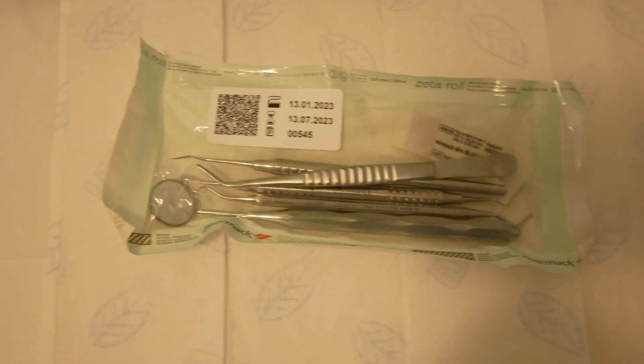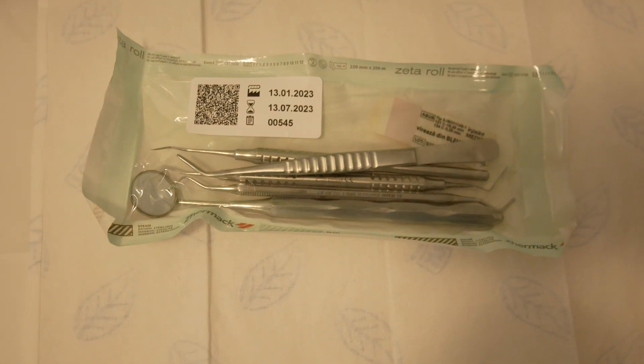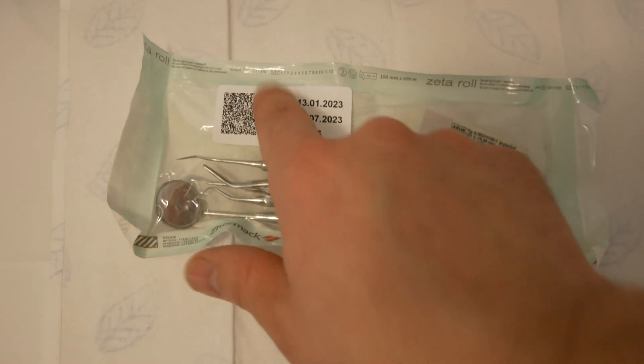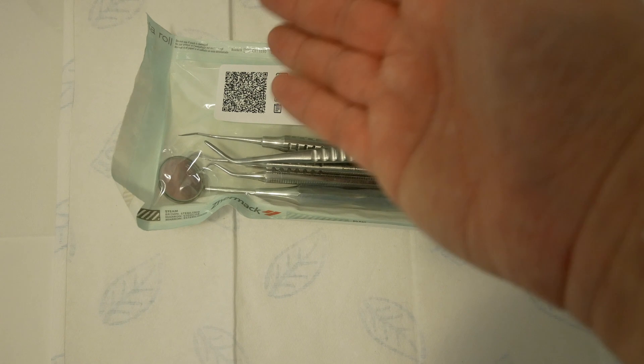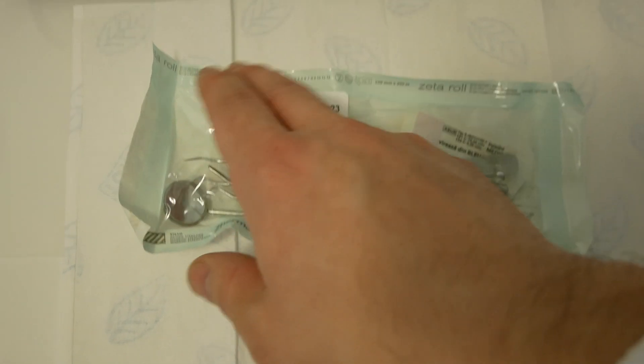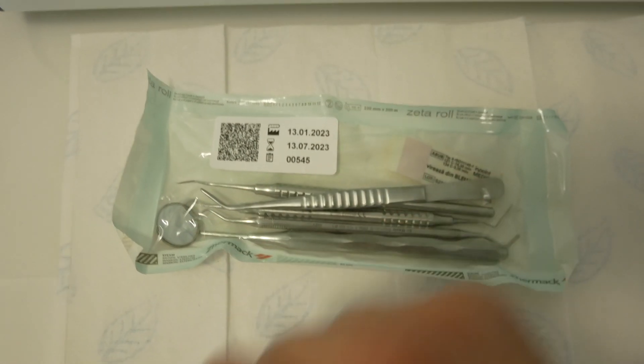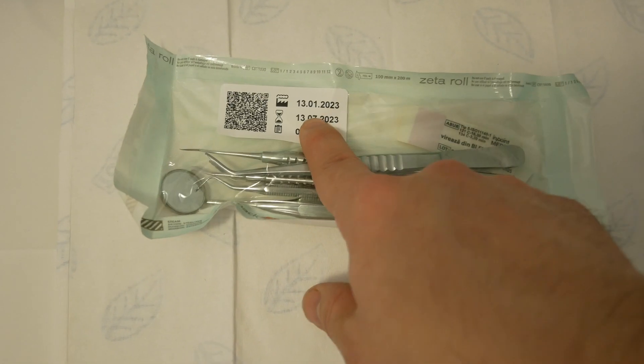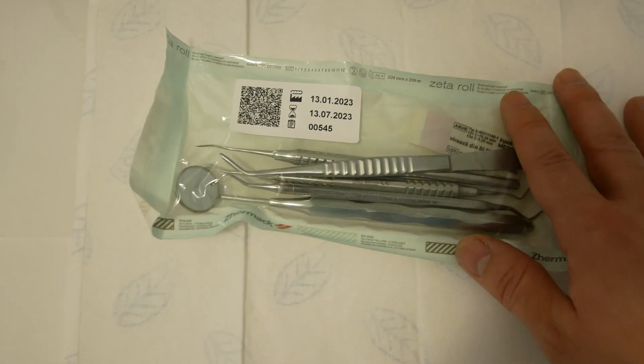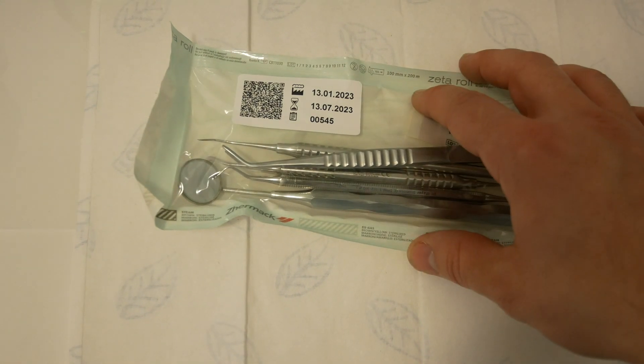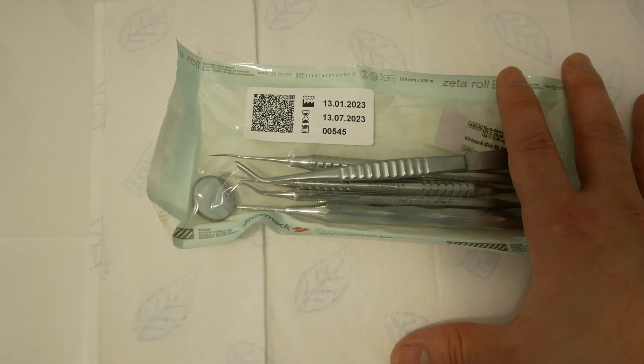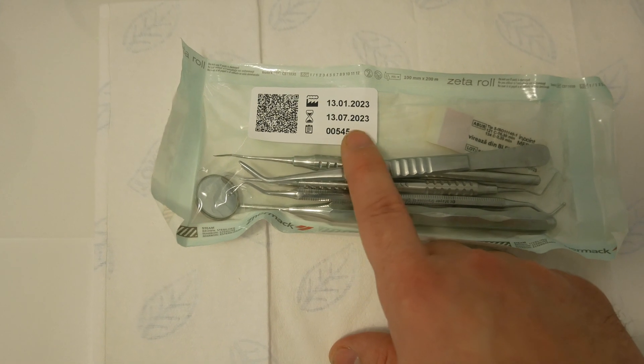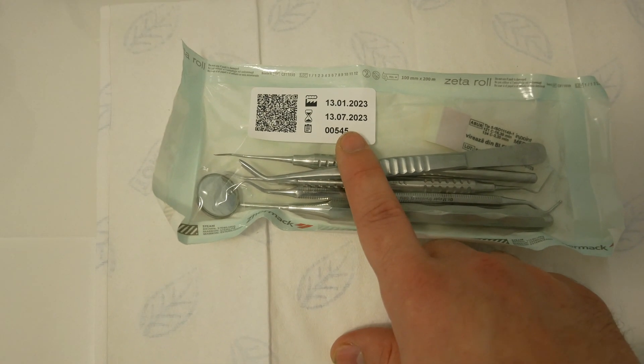I'm also labeling each bag with a QR code that contains all the information of the sterilization cycle, the sterilization date, the expiration date. The expiration date on this package for this manufacturer is six months and the number of the sterilization cycle.